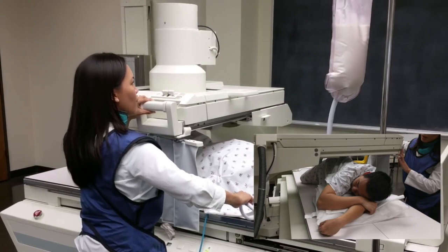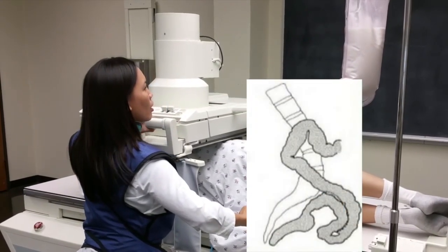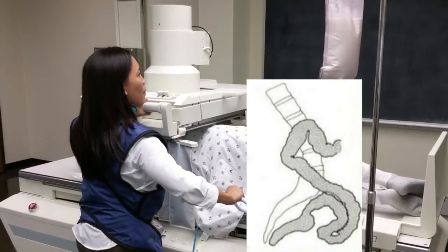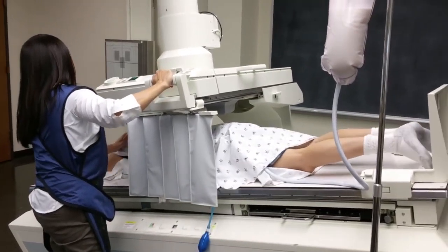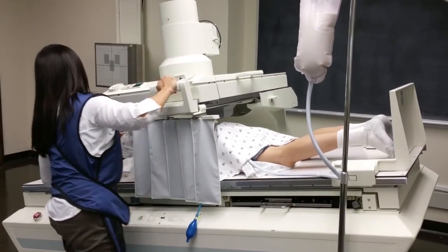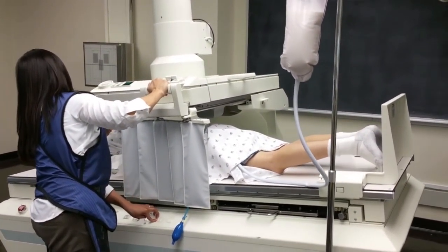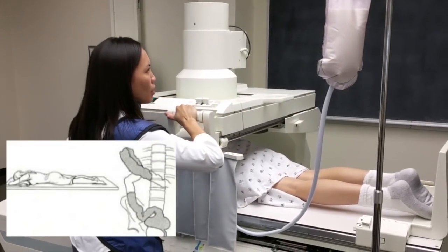The barium will pass from the descending colon into the splenic flexure and into the transverse colon with ease in most patients. But you can place the patient in a slight Trendelenburg position if the barium isn't moving into this area. Once a full column of barium reaches the apex of the splenic flexure, turning the patient to the prone position will move the barium into the middle of the transverse colon.